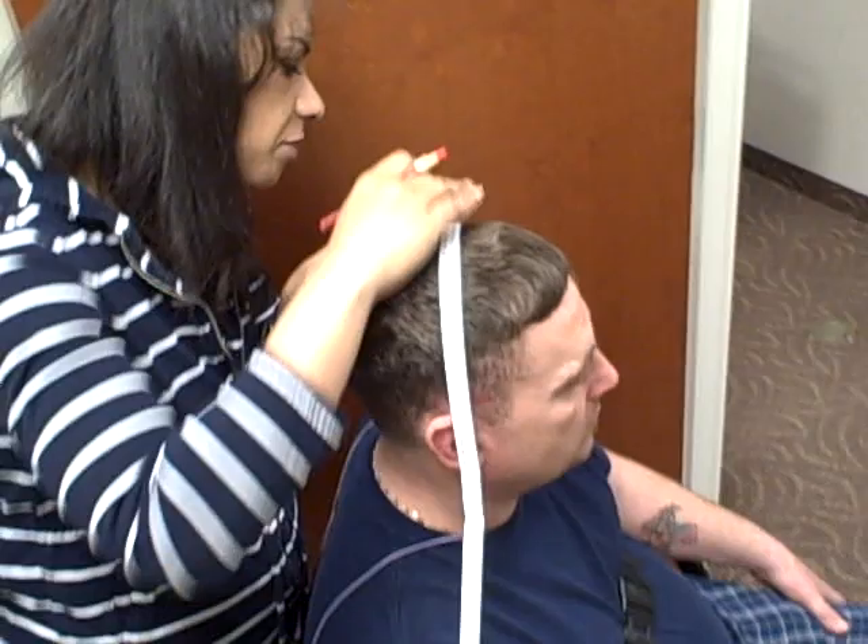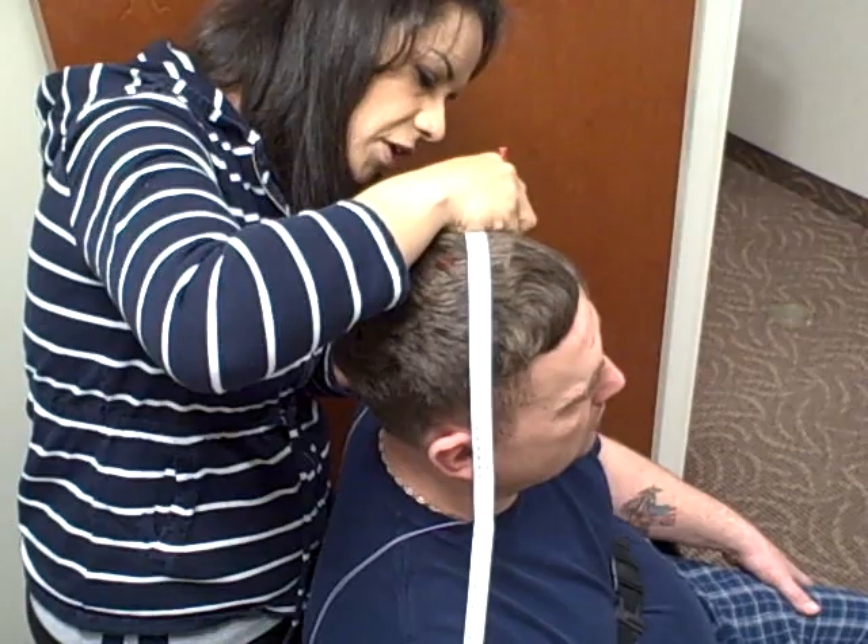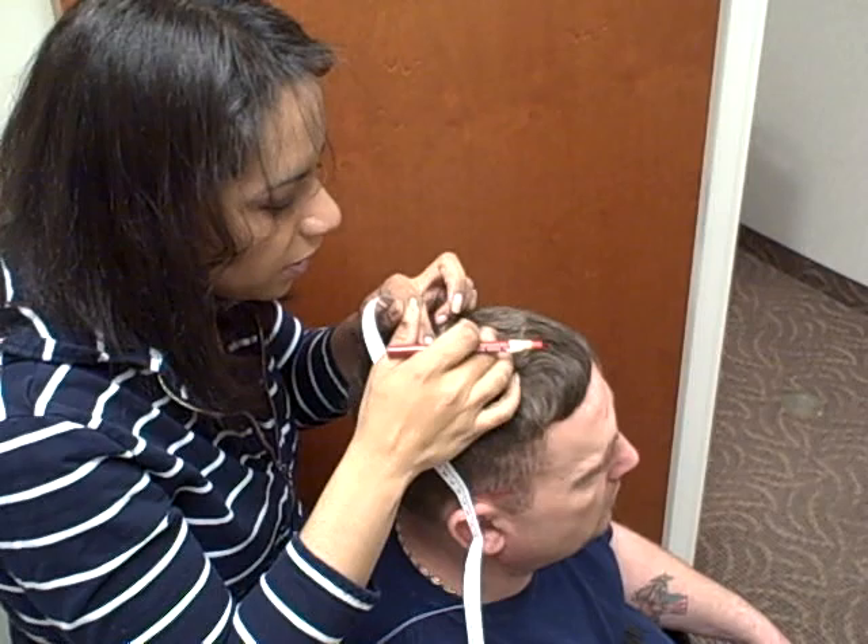I'm also going to come up 10% — so 3.8 centimeters — and make a mark there. I'm going to do the same on the other side and make a mark there as well. That will help your measurements later.